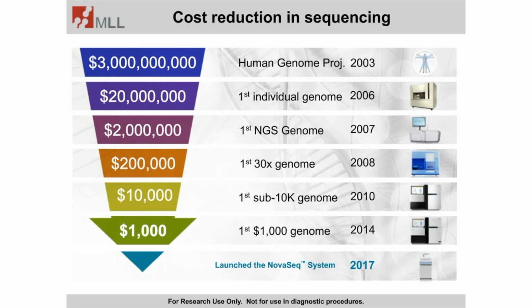And I have to admit also that these costs were calculated if you cover genome 30x. And I will tell you why this is of importance from our perspective for what we are doing right now with our moonshot. But anyhow, it seems to be possible that if this goes on a little bit further, there may be the option to use even whole genome sequencing in a diagnostic setting in the future.